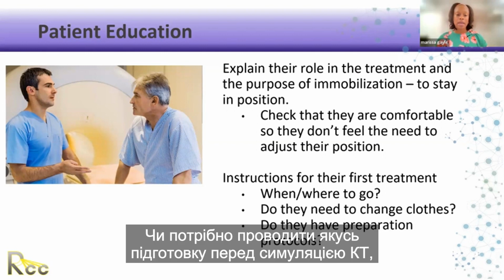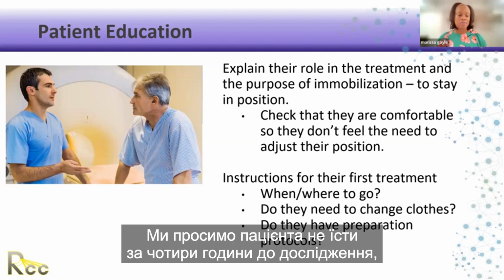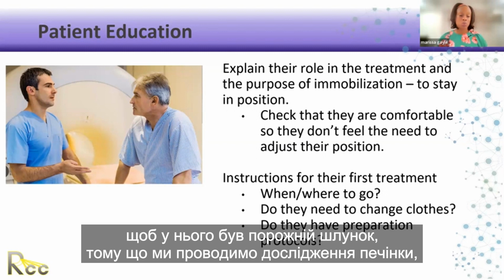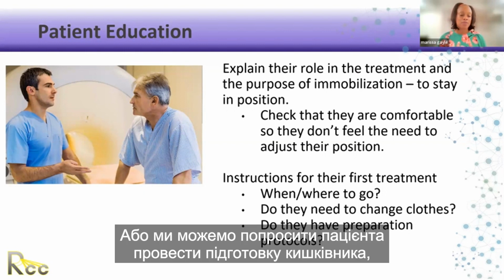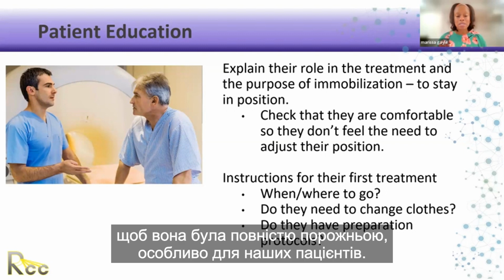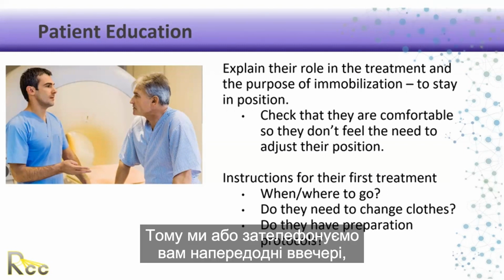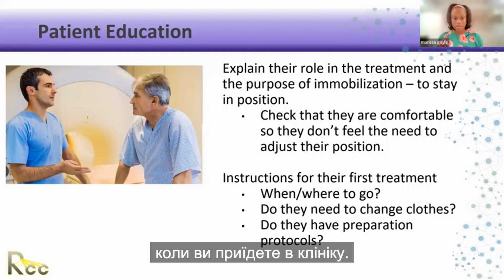Do I need to have any preps before the CT simulation? So some of our CT sims, we ask that the patient be NPO, not eat 4 hours before because they'll be given contrast. Or we want them to have an empty stomach because we're doing like a liver study and we don't want anything in their stomach that may push the liver out of the way. Or we may ask that they do a bowel prep, that their bowel is completely empty, especially for our patients. So we're going to either call you the night before to tell you what some of these instructions are, or we will give you these instructions once you arrive at the clinic.